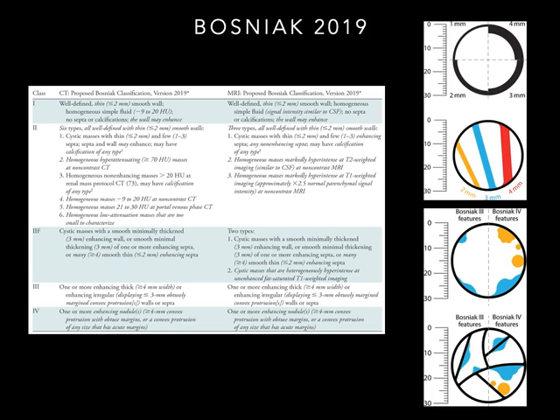This time round, they've made measurable aspects of it, so you can measure the width of the lesion wall, as in the top image. You measure the width of any septa in there, and then that gives you different classifications. You measure the nodules arising from the walls or from septa, and again that gives you different Bosniak classifications. Also very good in this is that the original Bosniak classification only worked for CT, whereas this also works for MRI. And what we're tending to find is a very positive impact.